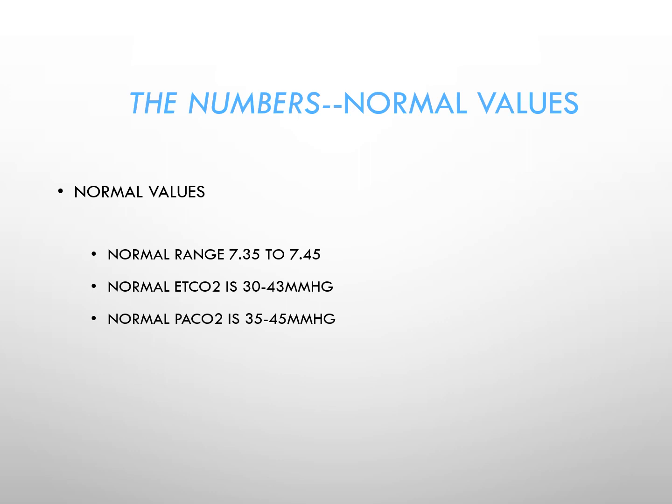So keep in mind that with all else constant and under normal conditions, the end-tidal CO2 will be beneath what you'd get in a blood gas, the PaCO2 rather. You'll also notice that the scale is not linear, in that the difference between end-tidal CO2 and PaCO2 is greater at the lower end of that scale.